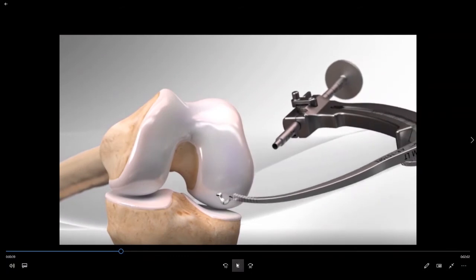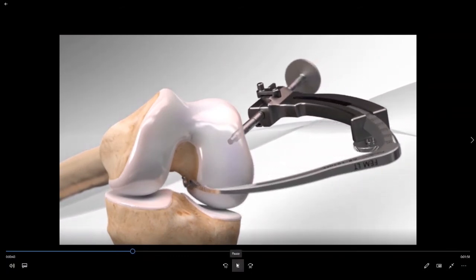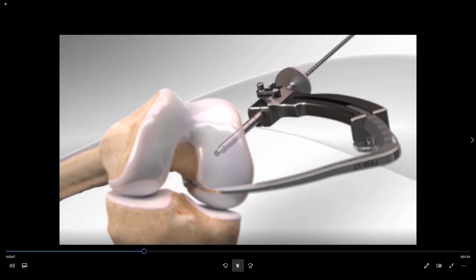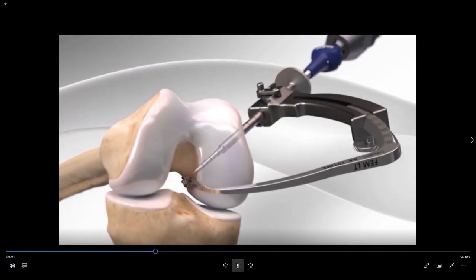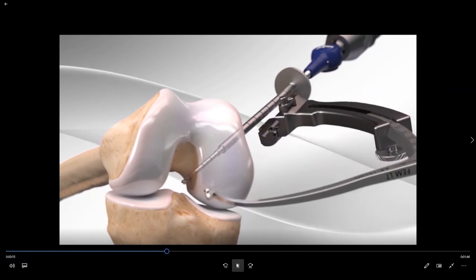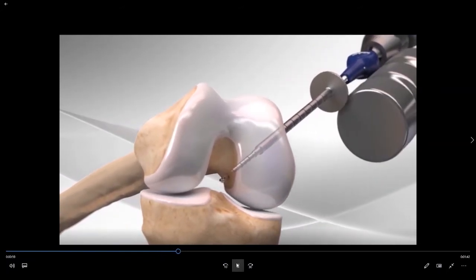We initially insert our drill guide through a small poke-hole incision in the skin. The pin is then drilled through the bone in order to come out at the precise location where we want the new ACL graft to attach. This pin is called a flip cutter.